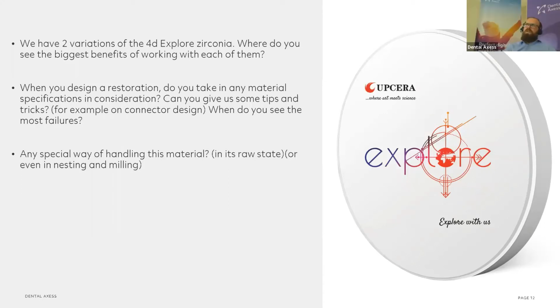Okay, yeah, no, definitely makes sense. I think that's a really useful tip. Like you said, you create a more mechanical retention. You're increasing your surface structure, and so there's more for your bonding material to connect to. That definitely makes sense. That's a good one.